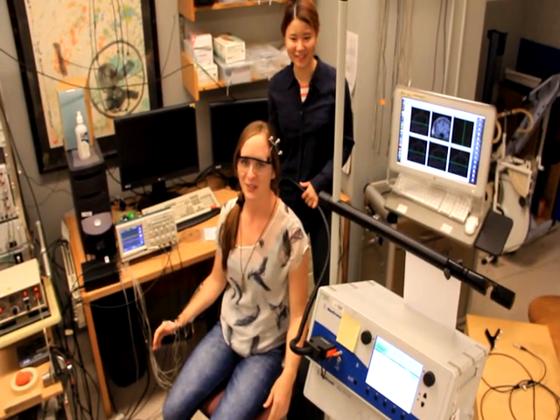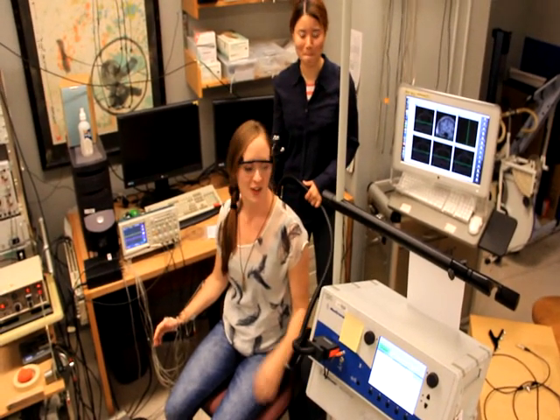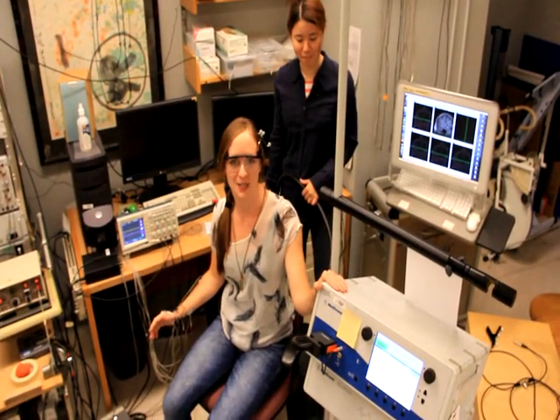Hi Recon! Welcome to our laboratory. Today we're going to show you how the transcranial magnetic stimulator works.